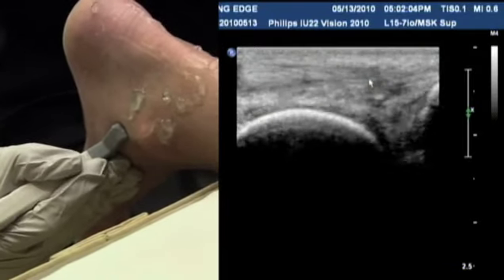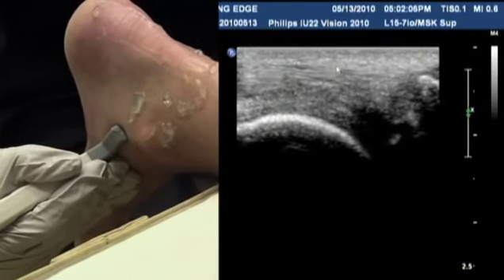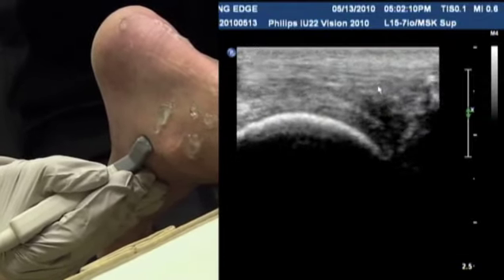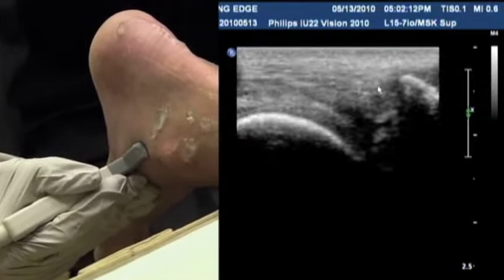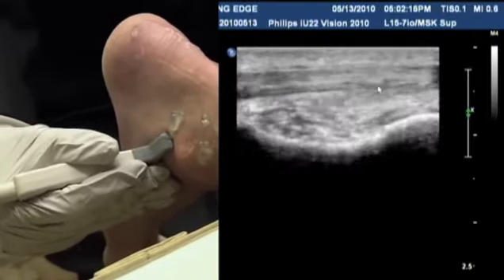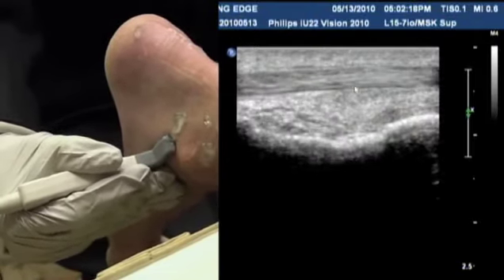So what ends up happening in this case is you're getting the fibers going from top up here and bottom going down. So you lose that 90 degrees that you normally see within a tendon. Sometimes it's normal to see a little bit of fluid there. He doesn't have any, but sometimes you'll see a little bit of fluid, which is just normal.